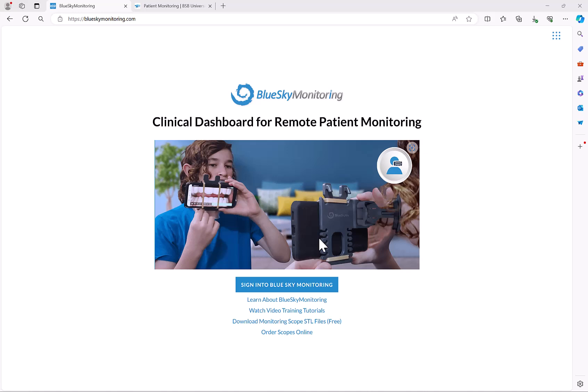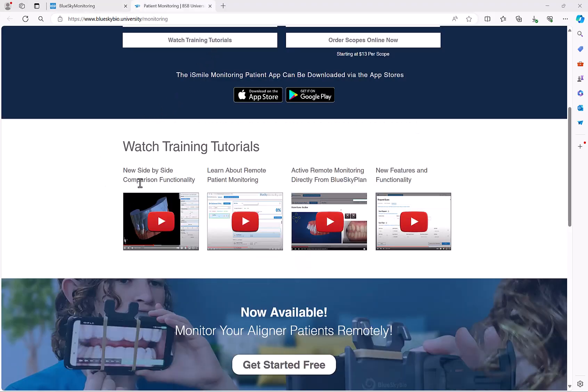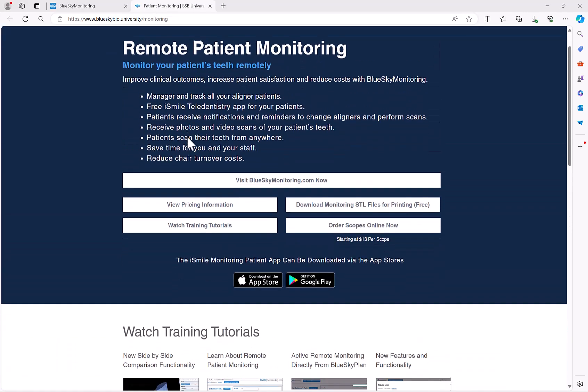On the other side of the screen right next to it, you'll see a 3D viewer containing the STL files for that particular aligner stage reflecting the digital plan. So on one side of the screen you get the real-time photos and videos from the patient; on the other side you have how the teeth are supposed to be set up for that particular step of the aligner treatment. You can see more information about the side-by-side comparison on the blueskybio.university/monitoring website.